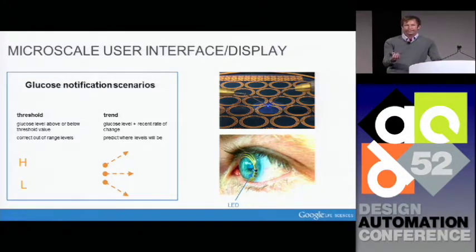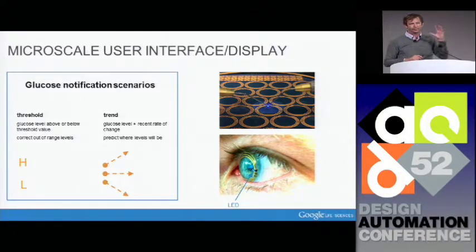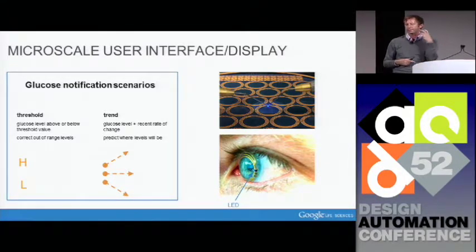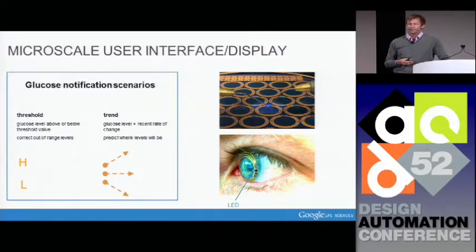So that's one way of getting data back to the user, but we also wanted to have additional, basically, alerts that we can provide to the person. And one way that we're considering doing this is a micro-scale user interface built into the contact lens. So we've been working hard on integrating tiny LEDs into the contact lens platform. So size, again, this is the recurring theme, size and power are extremely important. But fortunately, if you have a small light source in a contact lens, you don't need a lot of light. You're trying to illuminate a portion of the retina. So you're right there, you're close. You don't need a lot of light. But there are a few challenges. One is, of course, size of the device, and also focus.